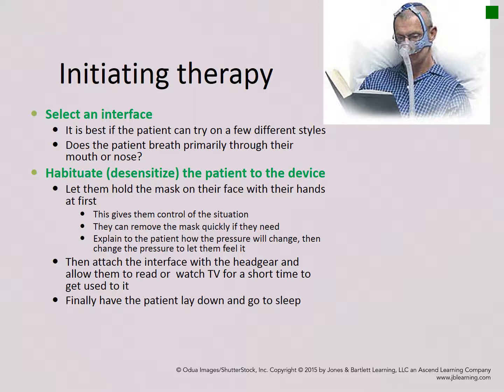Once they're comfortable, attach the headgear to it and have them put it on and allow them to sit quietly, read, or watch some TV just to get used to the sensation and adapt their breathing to how it's going to feel. This is not normal for people, so everyone maybe will take a little bit of time to get a little comfortable and be ready to close their eyes and try to sleep.